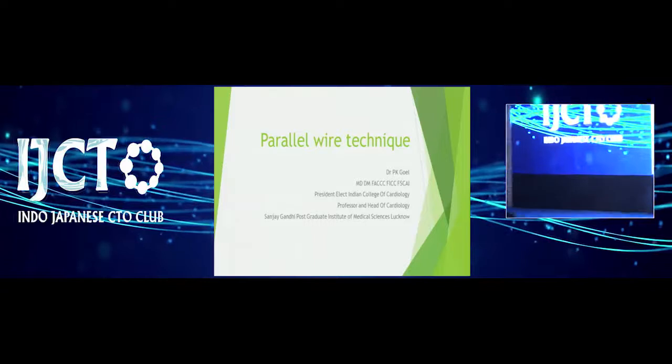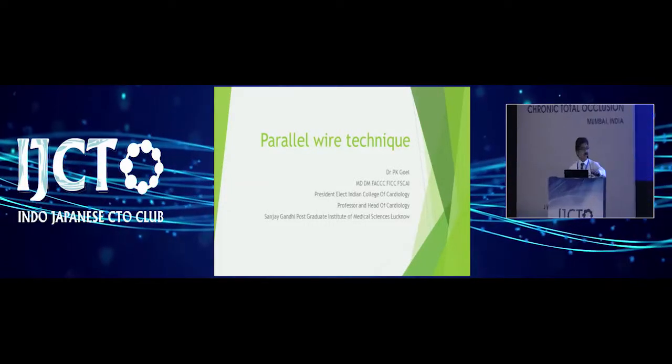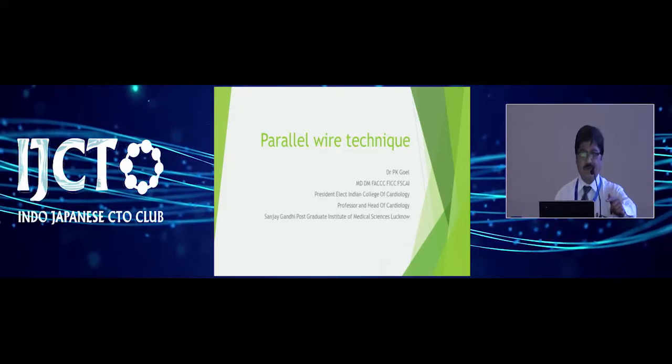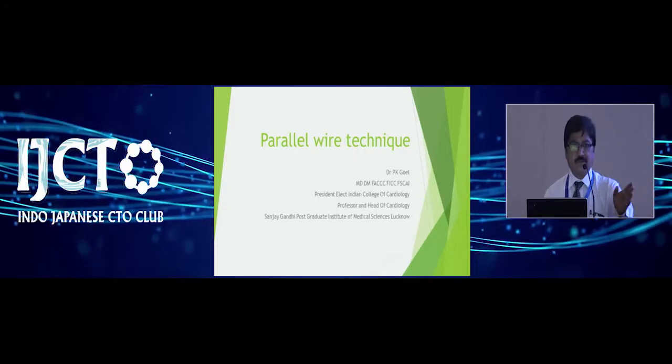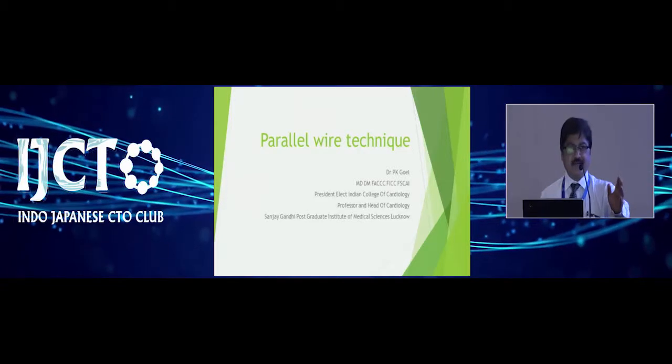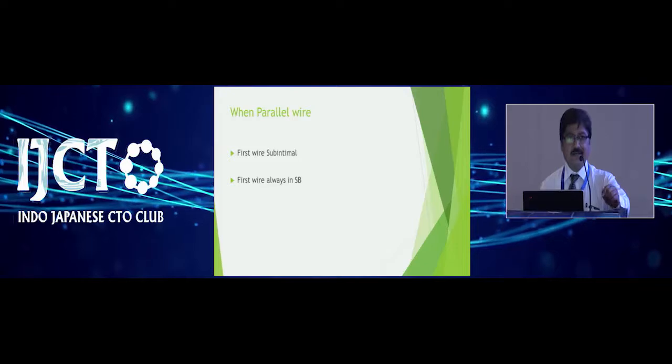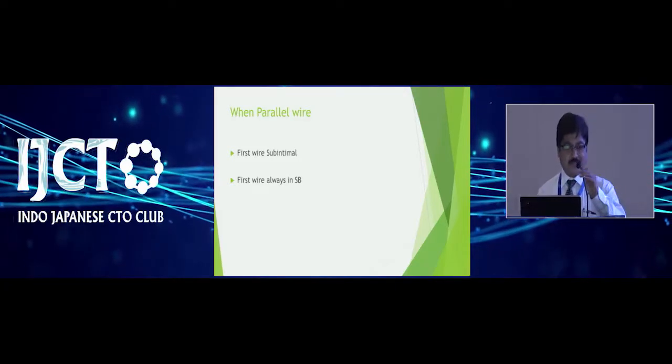Okay, friends, so I'm going to talk on the parallel wire technique. In fact, I should have ideally talked before Dr. Rathore, because you have the antegrade wiring. If it is failing, then you do parallel wire. If that also fails, then you go down to the stingray.